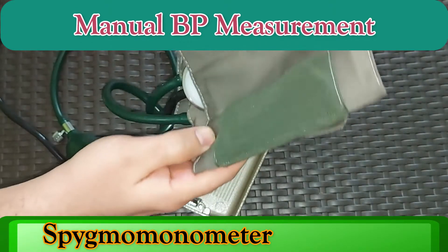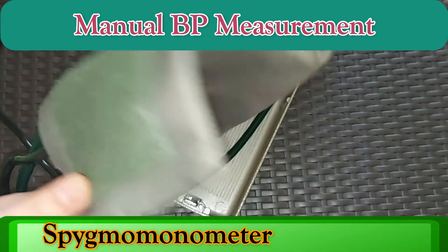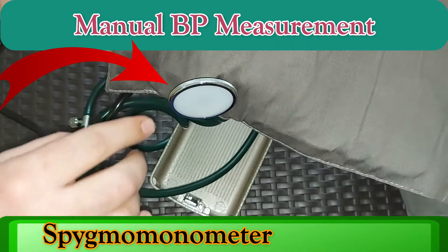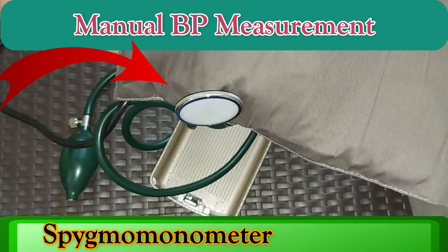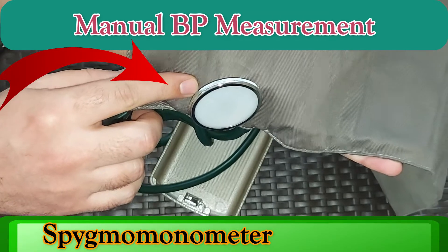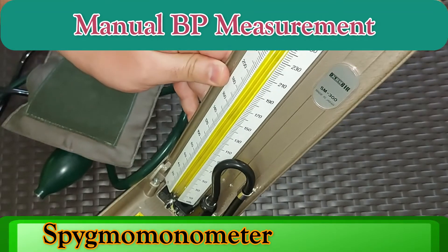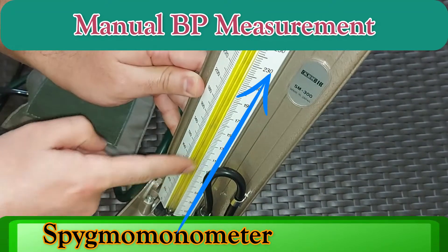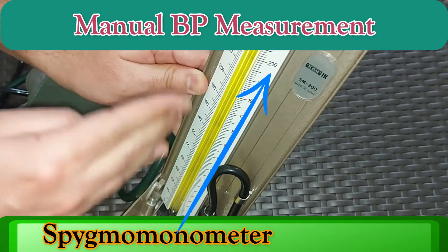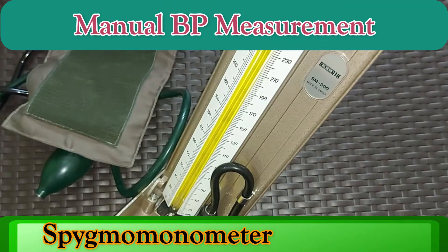This is called the BP cuff. You can open it and see — the stethoscope is already mounted on the BP cuff, which is convenient. Usually the stethoscope comes separately, but here it's already mounted on the BP cuff, so it's quite easy to adjust. At the end you will see the mercury meter — the numbers are already given on this meter. Later in this video I will also show you how to read this meter and how to measure your blood pressure using this mercury.